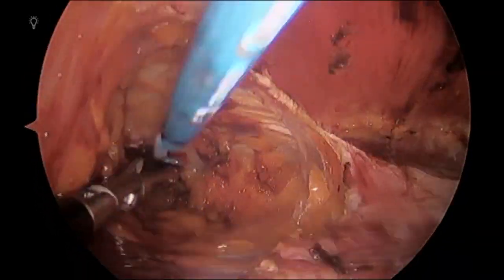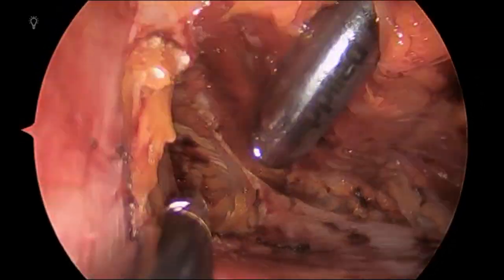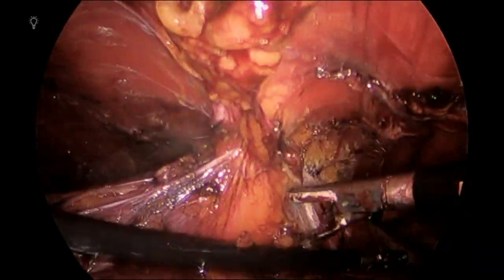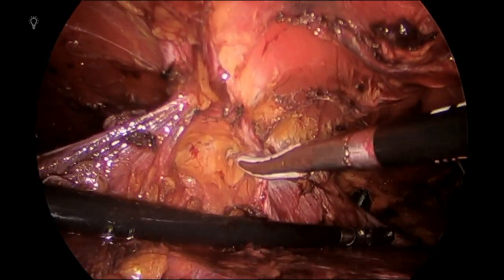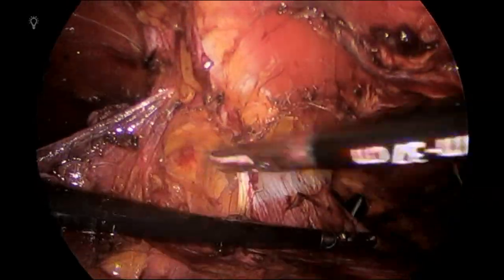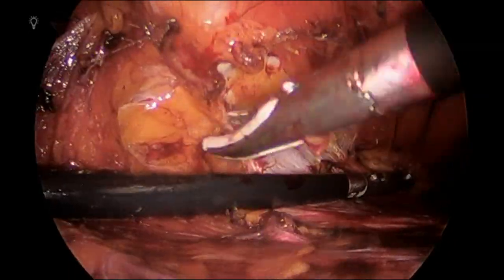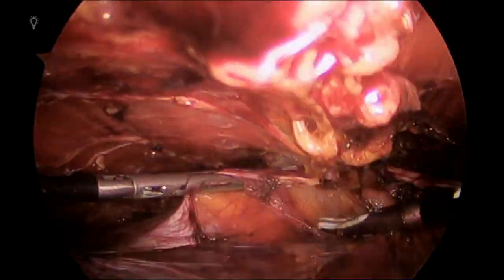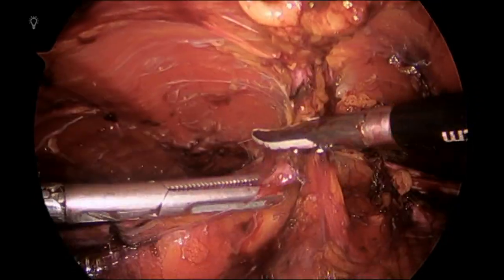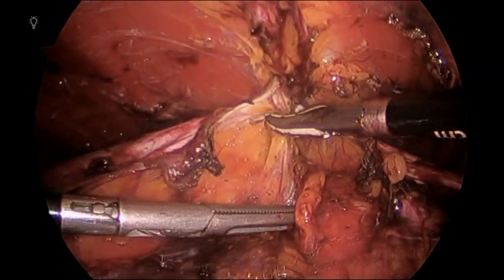At this point, I'm reaching the supraumbilical hernia, as you can see, and I am not able to reduce the fat. With the movement I did, a small peritoneal rim formed. As you can see, the cavity is diminishing, so I decided to perform the dissection bottoms up, entering the preperitoneal space and incising the posterior rectus sheath.